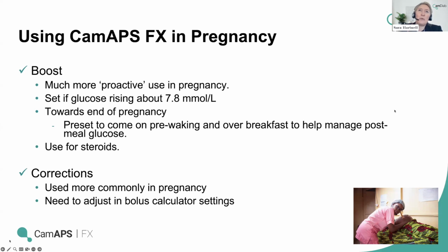We sometimes see people putting boost on for really short periods of time, like half an hour or even 15 minutes. It's not going to do anything in that period of time if you think about the action of the insulin. So just pop it on for 2 hours at once. You can always cancel it if you think you don't need it on anymore. But the great thing about boost, just to remind you, is that it only boosts if it needs to.